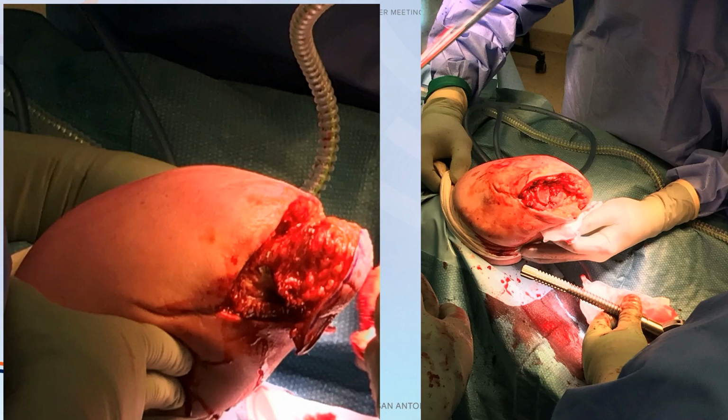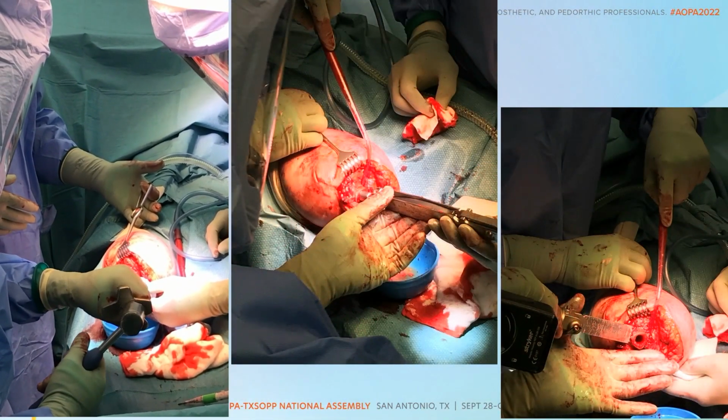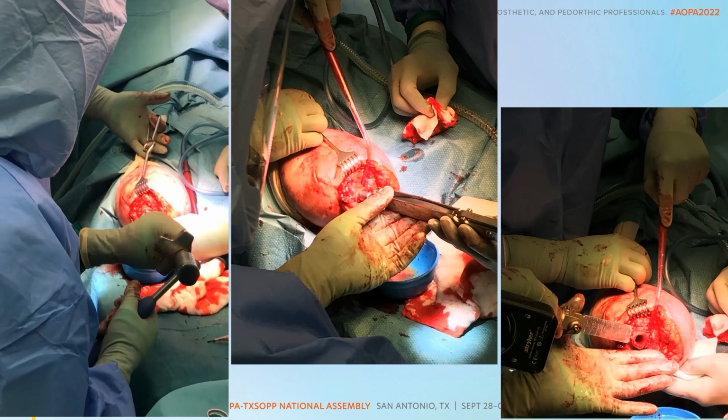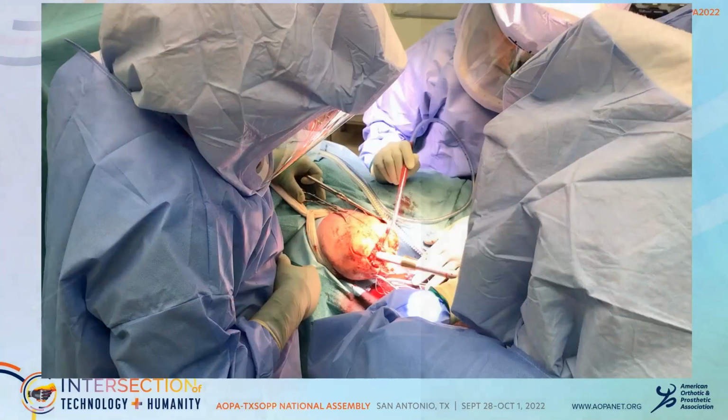We remove redundant soft tissue, muscle, with a pre-planned osteotomy level to assure that we have good knee centers and can accommodate the appropriate componentry below the device. After we remove the redundant soft tissue, we prepare the canal, and then also prepare sites where we create a myodesis, where we reattach the muscles so they have good control of the limb postoperatively.